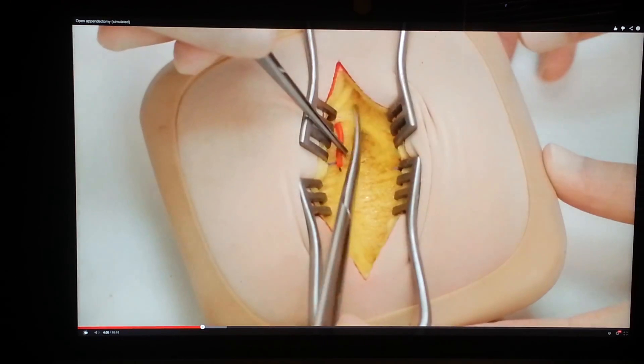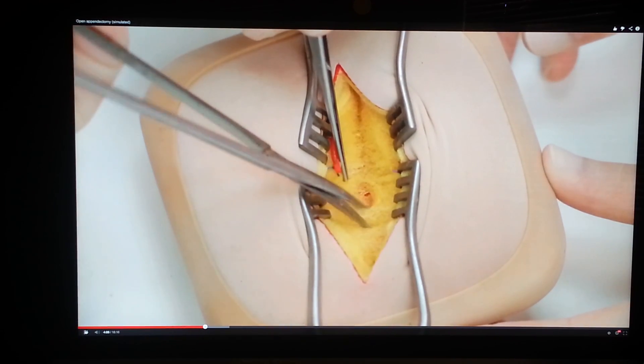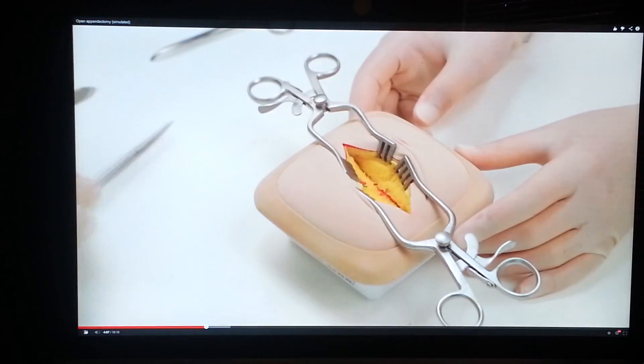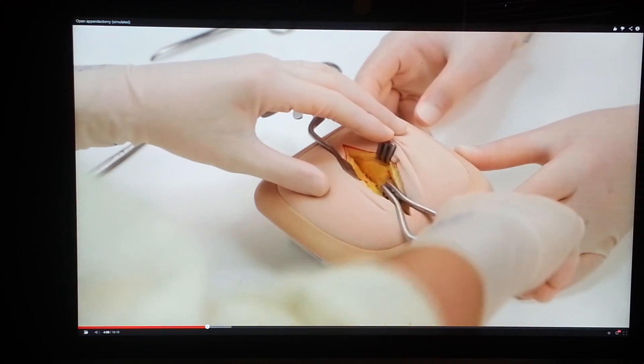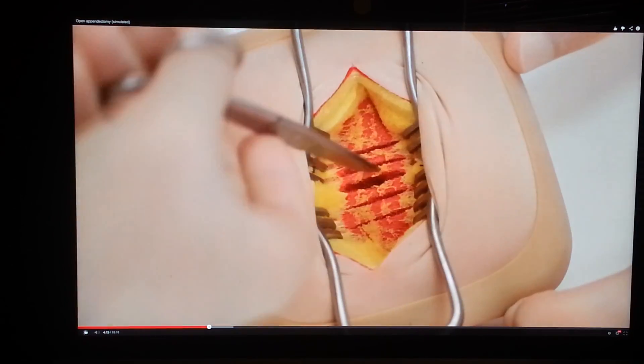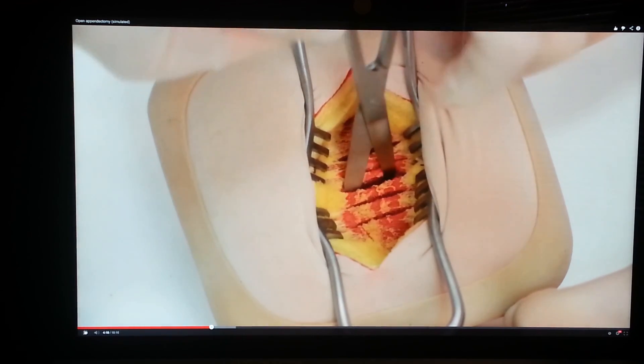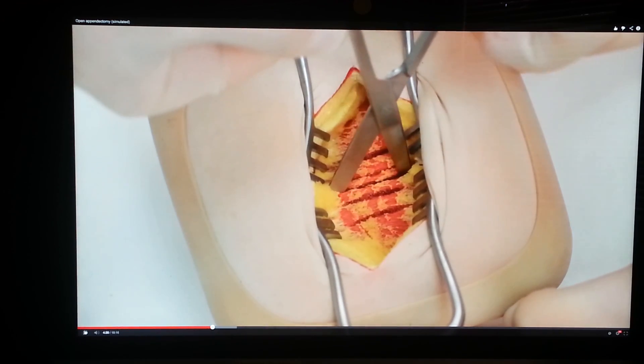Deepen the incision by dividing any connective tissue to expose the fibres of internal oblique. Again, reposition the self-retaining retractors so you have an optimum view. Internal oblique should be split rather than divided by opening Mayo's straight scissors in the line of its fibres.